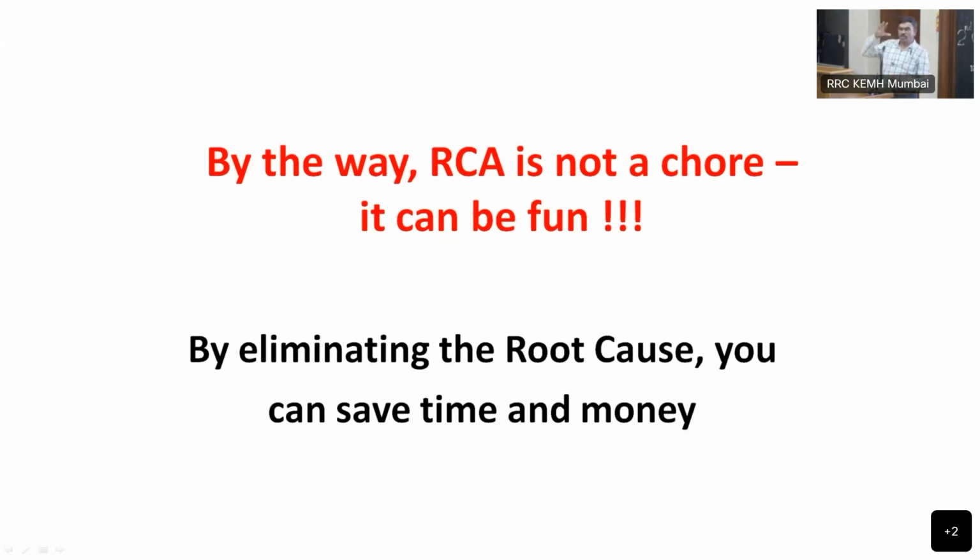Suppose someone has a network hospital and it receives samples from other labs or other centers. Okay? We should actually give the complete scenario. Say, for example, this is your beta HCG MoM, and this is the national average of beta HCG. And this is how your hospital is behaving. Probably these are the number of rejections, the number of hemolysis you are having, the number of inadequate samples you are having.